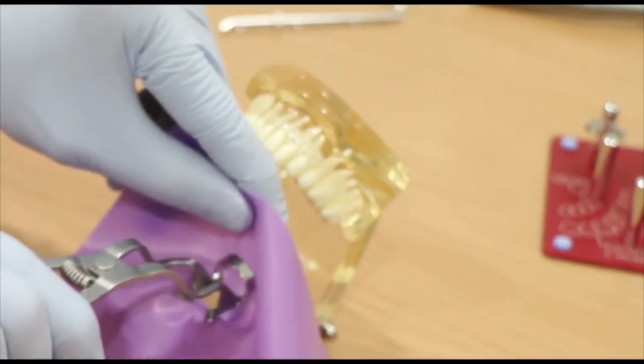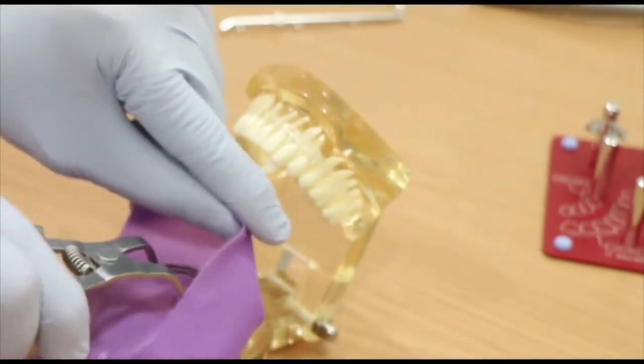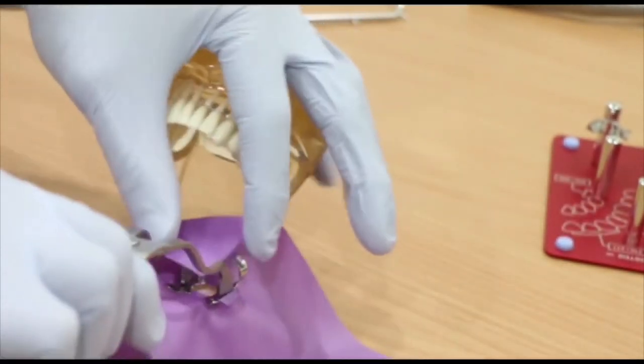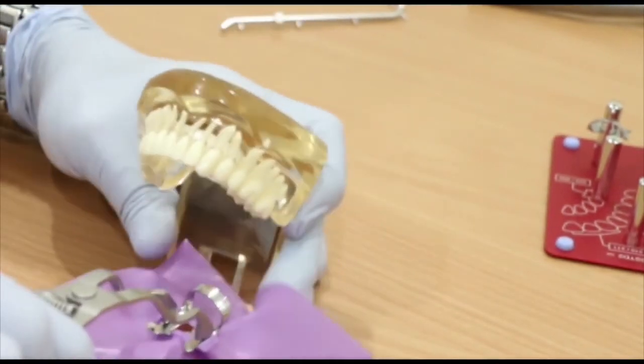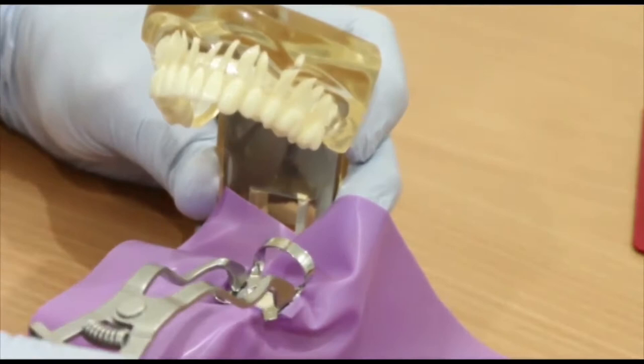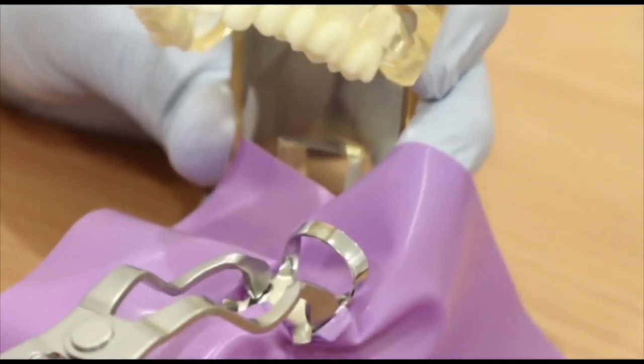It's because when we place it between the teeth, we are bound to be adjusting our position, and we are bound to be slitting the rubber dam between the teeth to have a good placement.